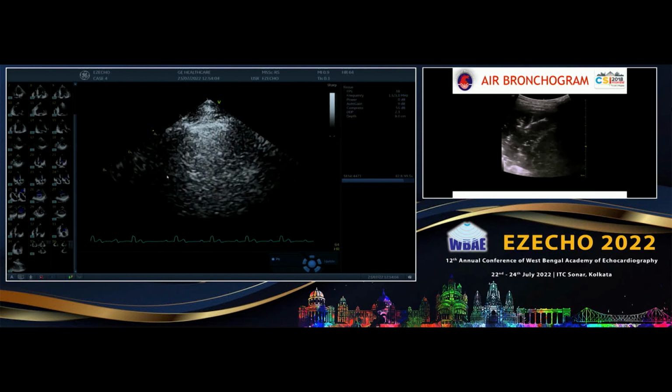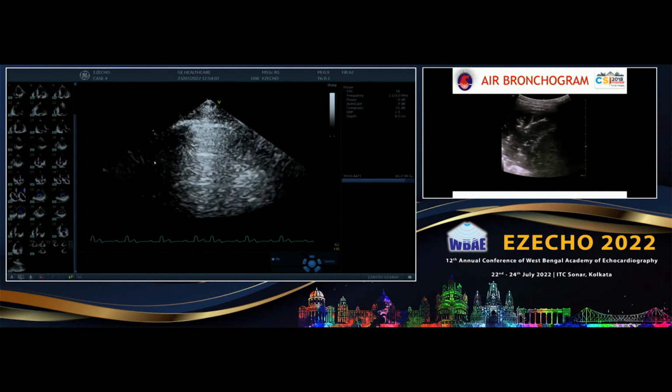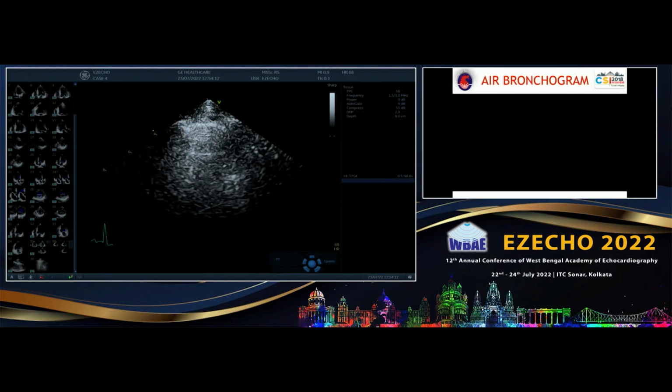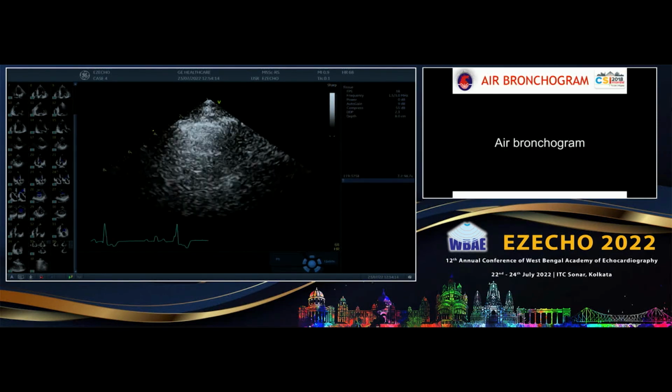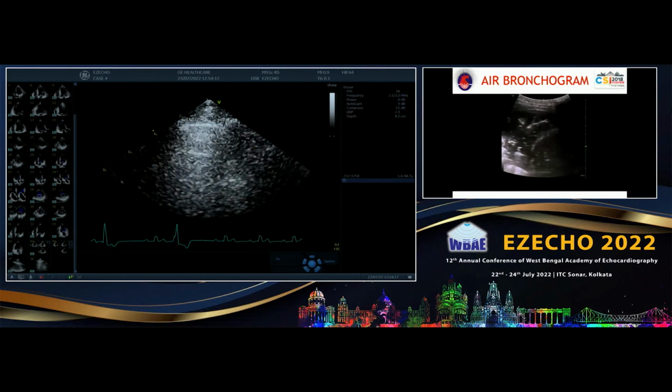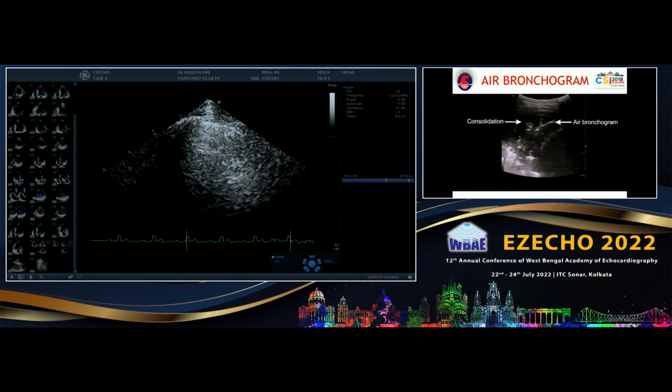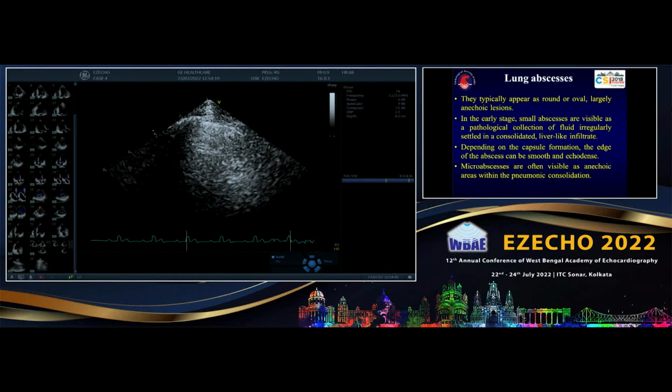And these are all lines in the lung. See, this is all transverse lines. These are A lines, normal aerated lung. Use your echo probe very well. Once you change to another probe, your orientation may change. And when you don't have this convex probe on your echo machine, especially if you are carrying a V-scan, sorry, you can do it with any probe. Echo probe is also good enough. When you are carrying the pocket ultrasound with you, generally you have got only the echo probe. But you can see the comets very well. Don't worry about that. You may not see the pleural sliding.